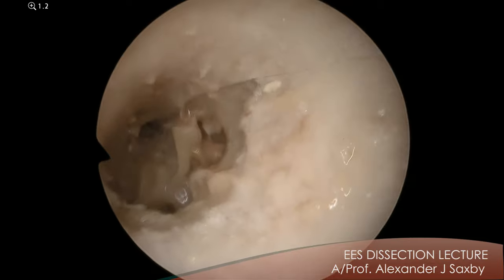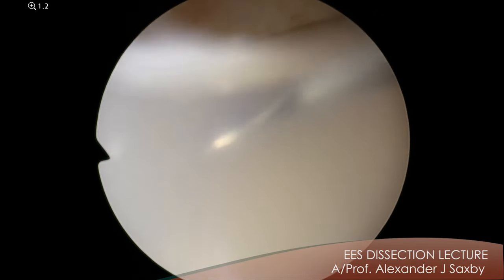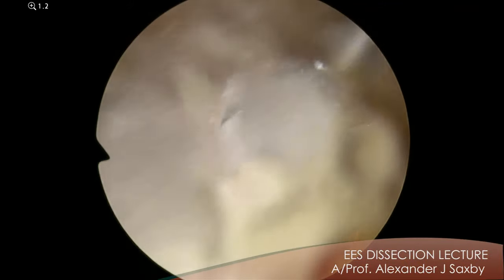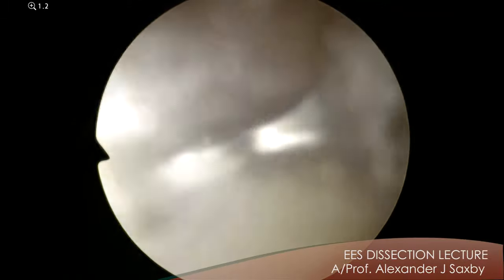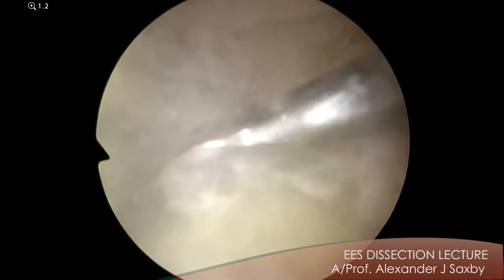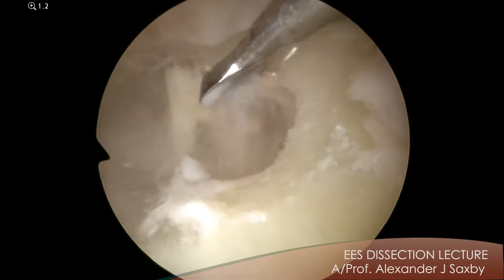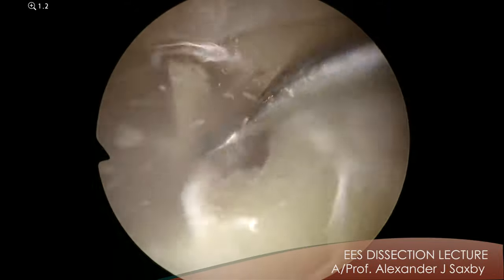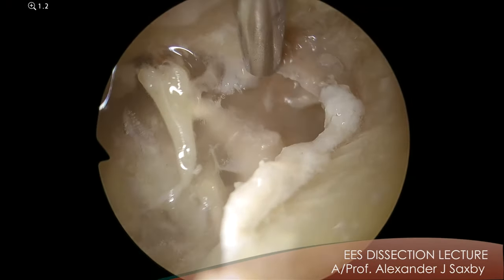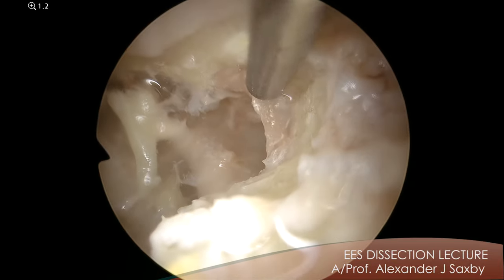So let's use the Mectron device now. So I'm going to curette the attic now. You use this like a curette — a powered curette. Can you see how that cuts the bone and leaves the mucosa alone? It's quite incredible. See how the mucosa is completely preserved there. It's just taking the bone.